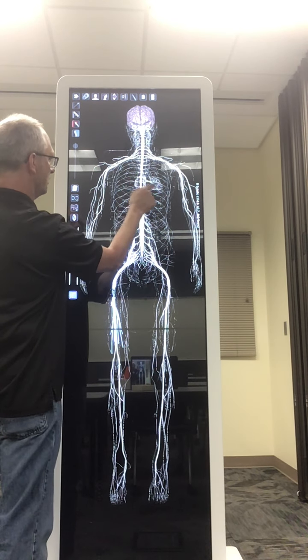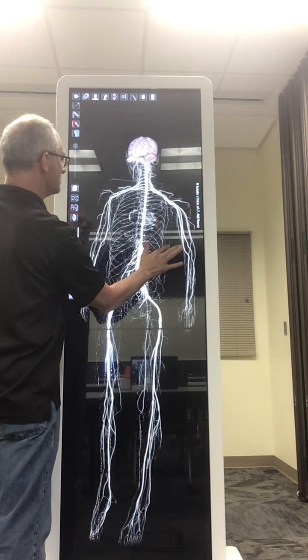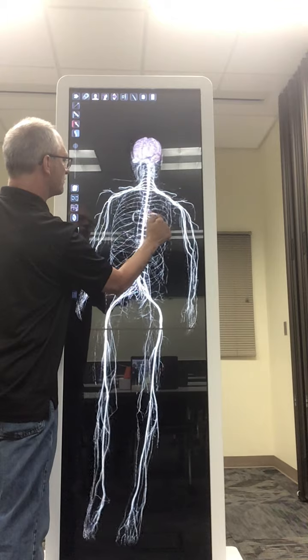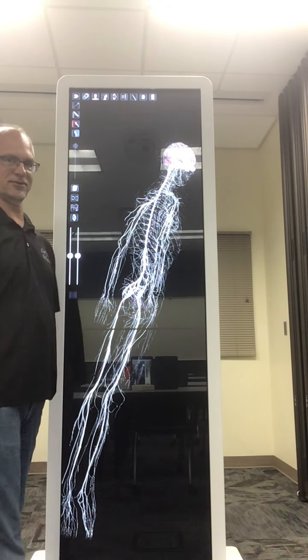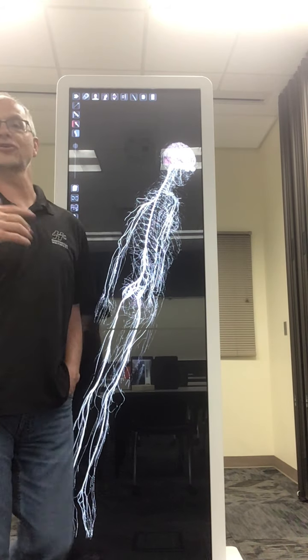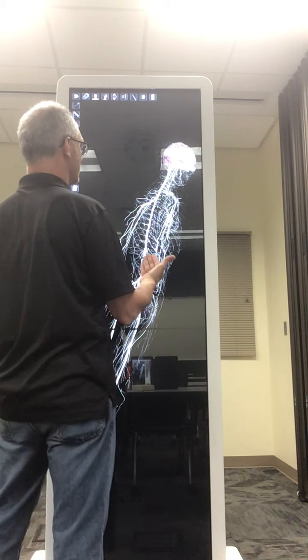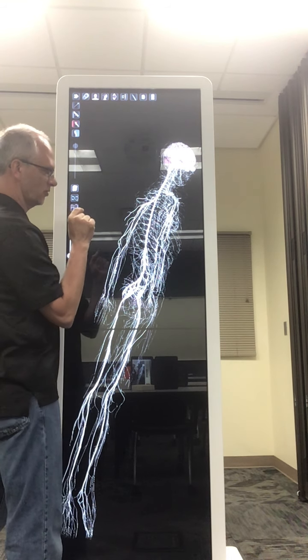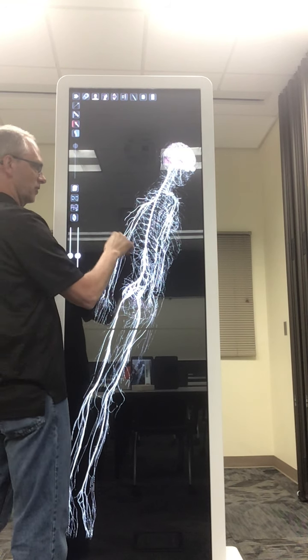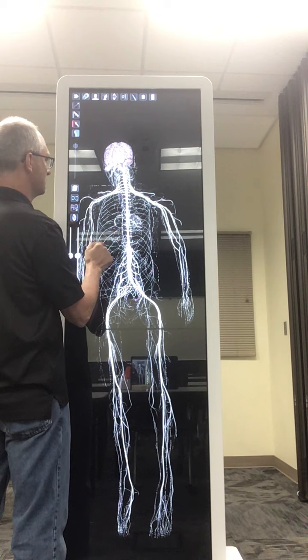So we can also see, if we turn it, this branch right here, that branch right there, and that branch right there. Those branches are going out. You can see that would be representing where each of your ribs is. This segmentation is according to your ribs, your vertebrae, and your nerves. They're all the same, right? You can see they match.